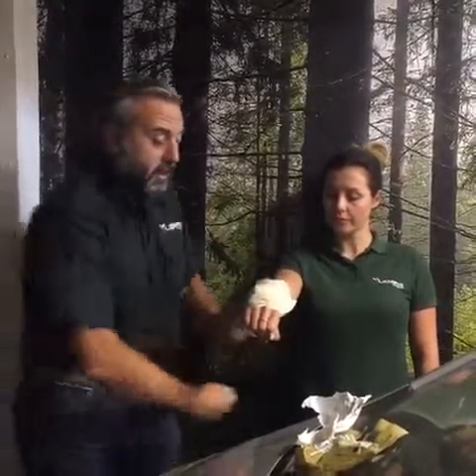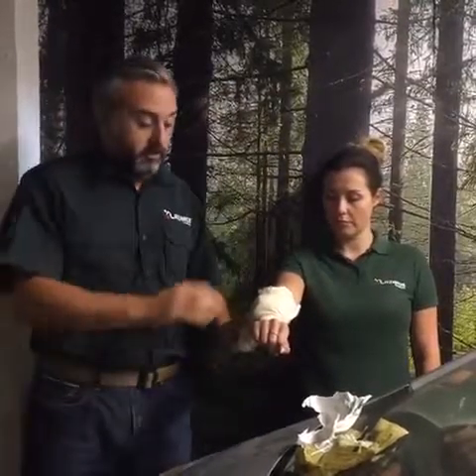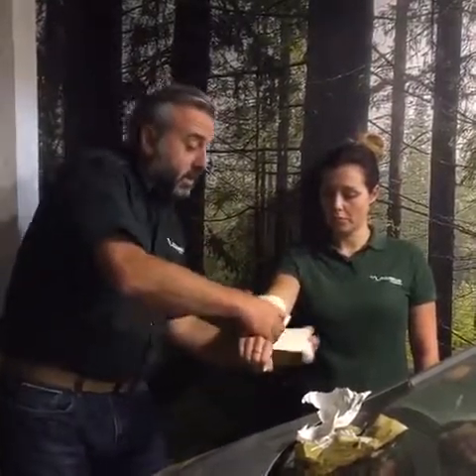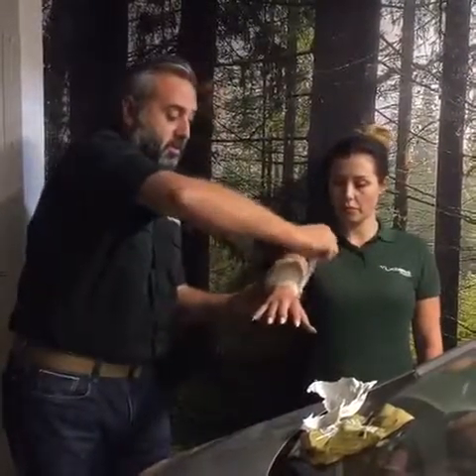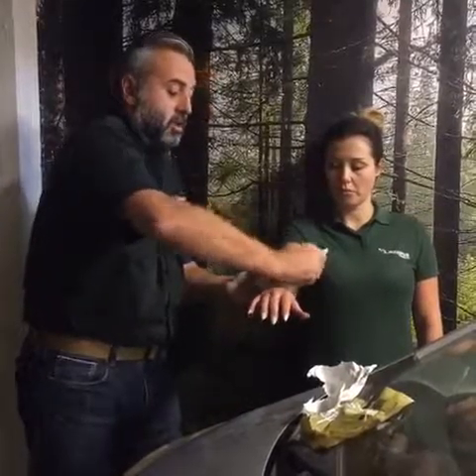As it goes along, they've got a really neat feature built in. When we're bandaging it around, we want to try and keep close to the limb — it's quicker, and you get more control over the application of tension. They've built in little Velcro staves so that when you let go, it only unrolls a tiny way. I've gone around one end, come around the other, and that's secured in place. Now we do the hard work of going through the middle, driving that cup — our aiming mark — into the wound to secure it.